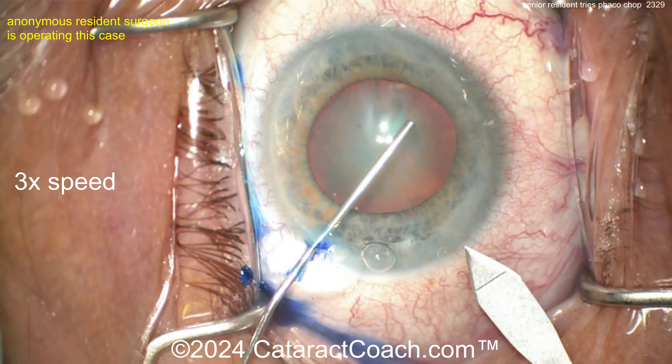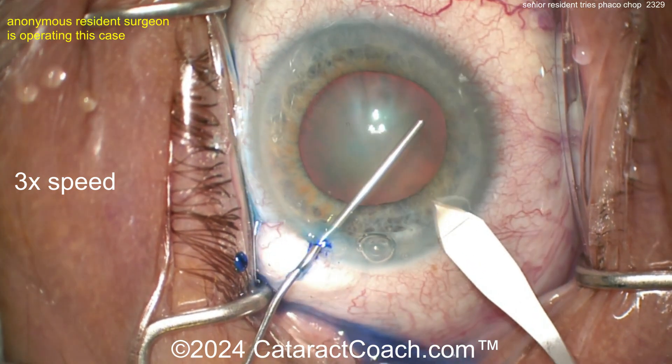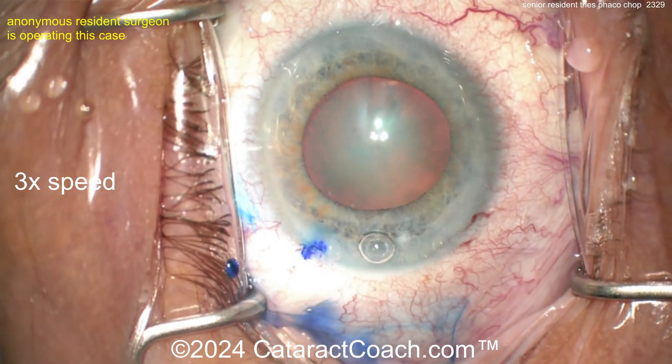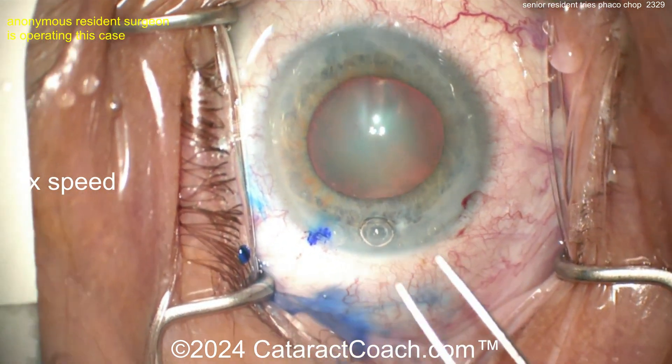Good little expansion of the pupil as well, holding the eye with that cannula. The incision looks pretty good — I'll take it, it's tolerable. Now let's get the rhexis done.